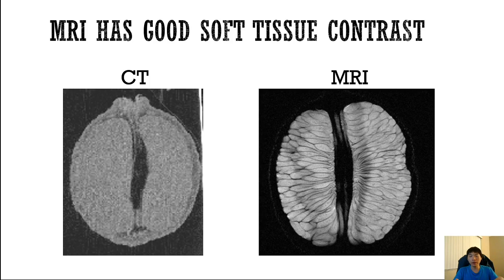Whereas MRI, on the other hand, because it uses a strong magnet, certain patients might not be eligible to have an MRI. So for example, if they have a metal implant, or if they have a pacemaker or some sort of implanted electrical device, or sometimes even if they have a tattoo, which may have metal fragments or metal particles in the ink, then for these patients, they may be contraindicated for MRI because there are risks. For example, the metal implants, if they're magnetic, can be pulled so they can feel forces from the magnetic field, and that can cause mechanical injury.